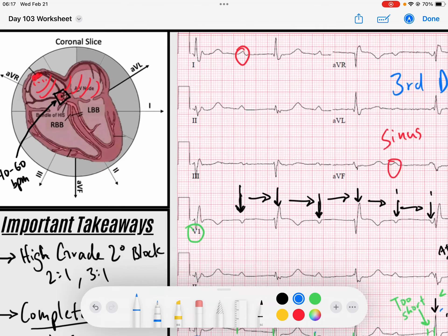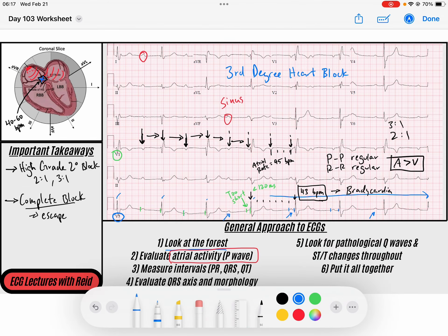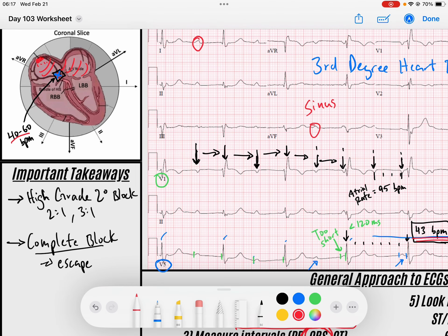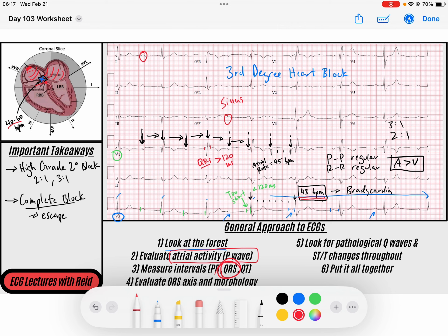The AV node is completely blocked - none of that P wave signal is getting to the QRS. That's why there's no association between the two. Now we need to figure out where the QRS is coming from. We have an escape rhythm - it has to be - at 43 beats per minute. That tells me maybe it's coming from the ventricles, or maybe from the junction of the ventricles, since we can have junctional escape rhythms. Looking at the QRS complex, it's a little bit wide - the QRS duration is greater than 120 milliseconds - which makes me think this could be a ventricular escape rhythm, though bundle branch blocks can also be associated with junctional escapes.